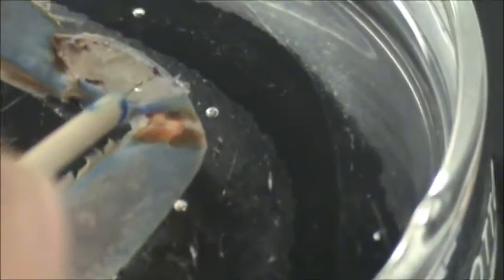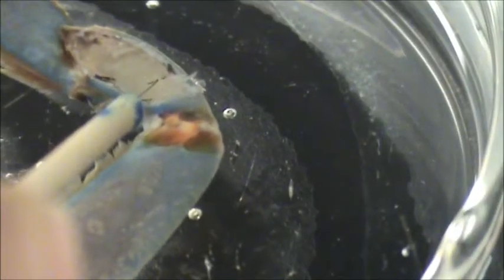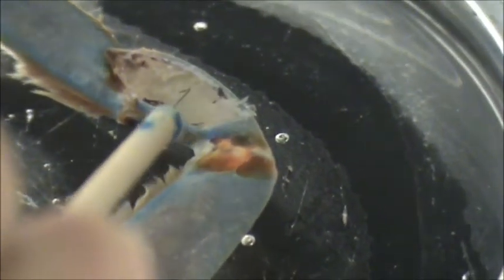I can see it now here. There's a big nerve bundle. On this side, look at this side, then you can see here a big nerve bundle. A branch of motor nerves comes out here and goes to those muscle fibers. Then we can stimulate this motor nerve.